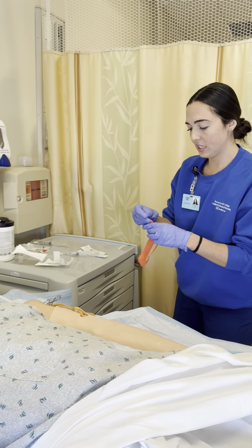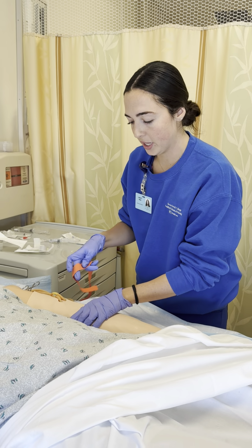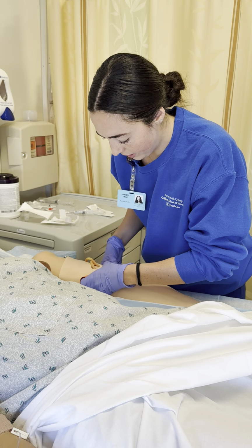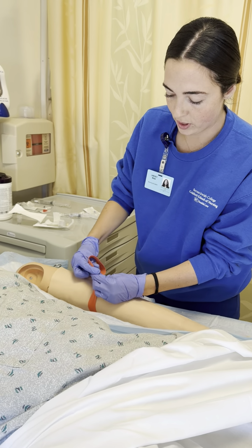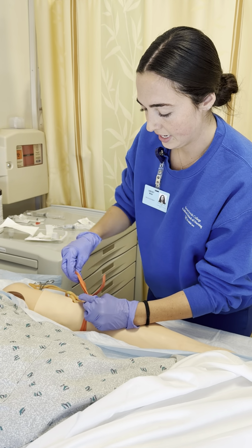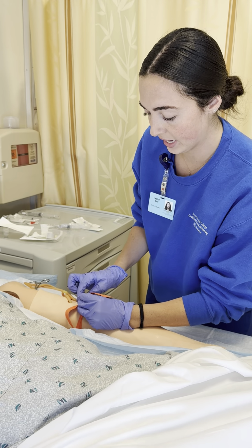Alright, so the first thing that we're going to do is take our tourniquet and apply it above the AC here. Okay, Ivy, so we're going to get started. I'm going to pull this up tight here and I'm just going to loop it under to ensure that I have quick access relief.